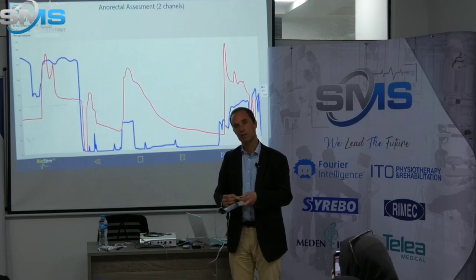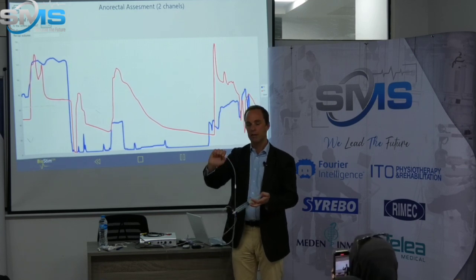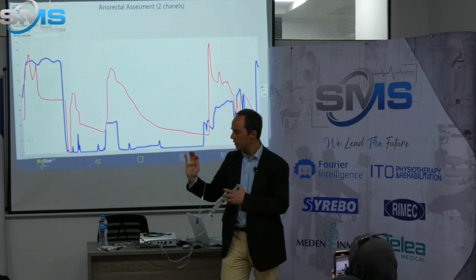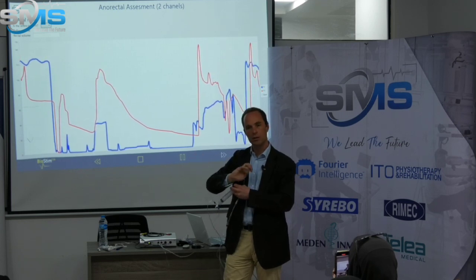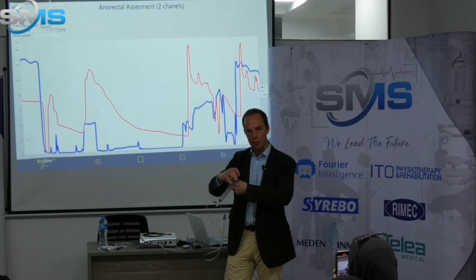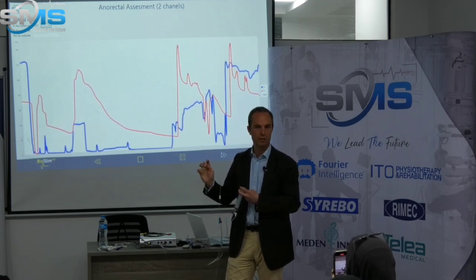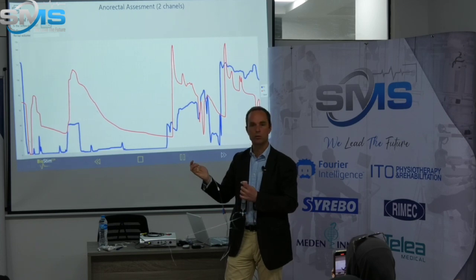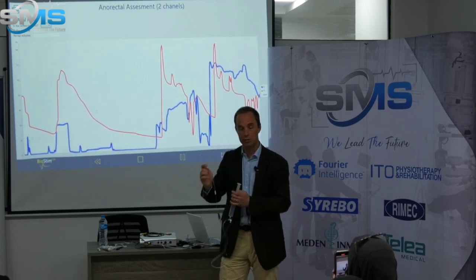How do I know if the rectum is small or big? You'll know because with this you inflate it as much as possible, and you ask your patient when he cannot stand it anymore. That's the moment where you have the total volume, and you will see if it's small or big. Usually it should be around 200 milliliters.